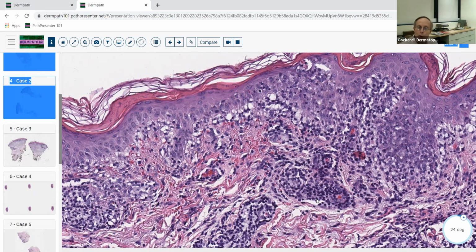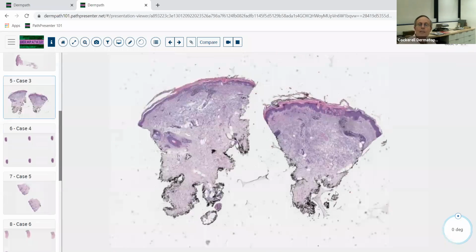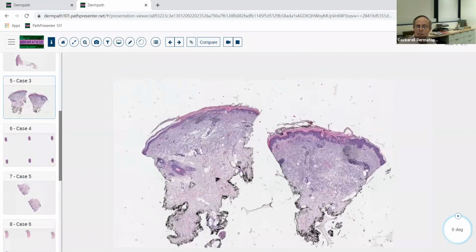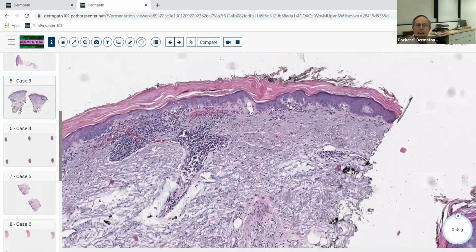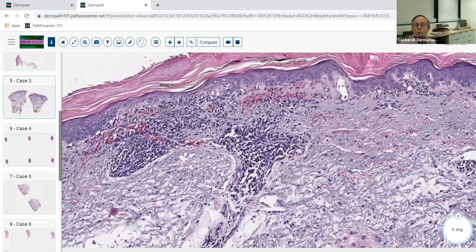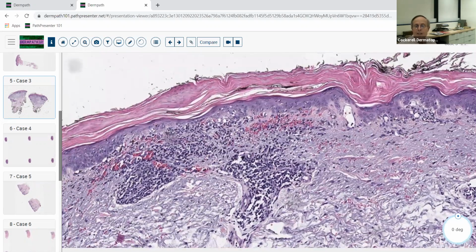So this is an acute process here. Could be for somebody that had the disease for a long time, but it's a relatively acute lesion. So let's look at another example. This looks kind of similar, and this is somebody that had the same disease, but this guy had it for a long time. So this is more of a chronic Pityriasis lichenoides chronica.